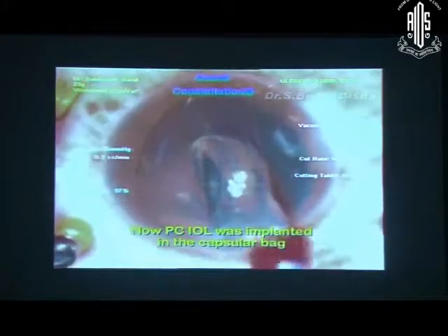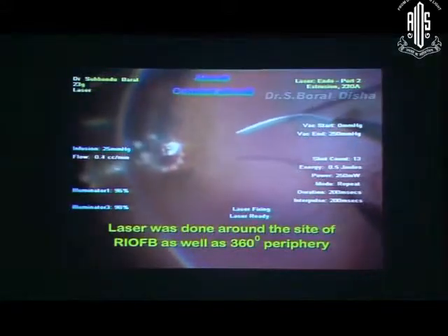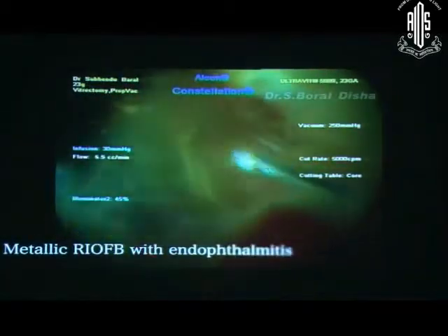Through that cataract wound I removed the foreign body — it was not that big. So now this is the time to inject the IOL. You should not place the IOL previously just after doing cataract; you should always use this rent area to remove the RIOFB first. A lot of pigmentary changes had already happened. So I did laser around the RIOFB site.